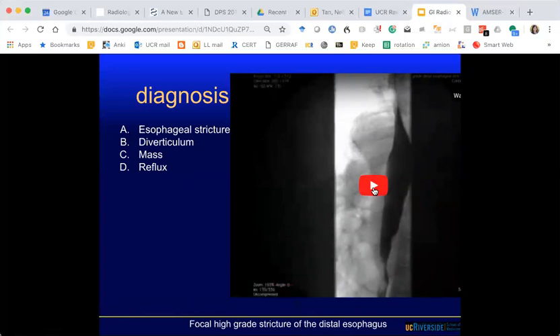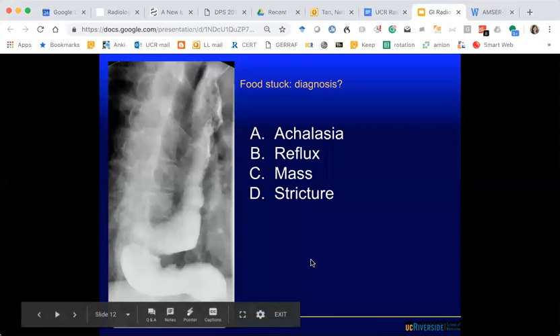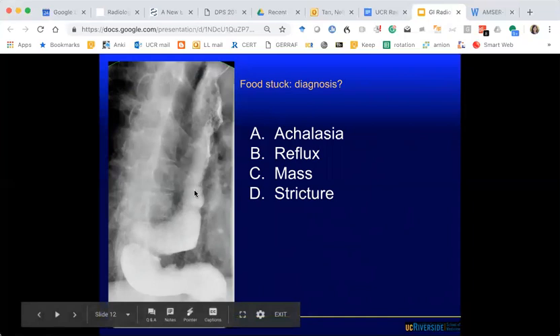What is the diagnosis here? It's another esophagram and we see the dilated esophagus with a standing column of contrast. Some guesses are a stricture. We'll review that.